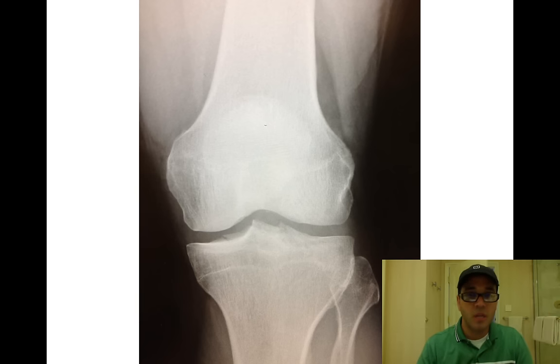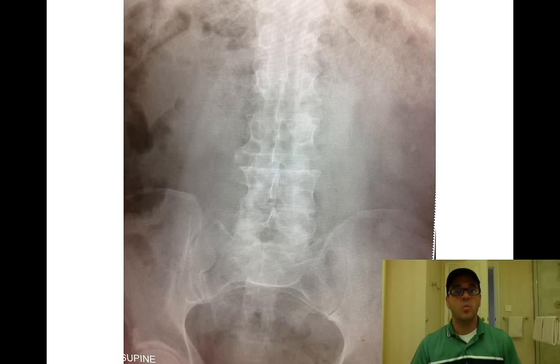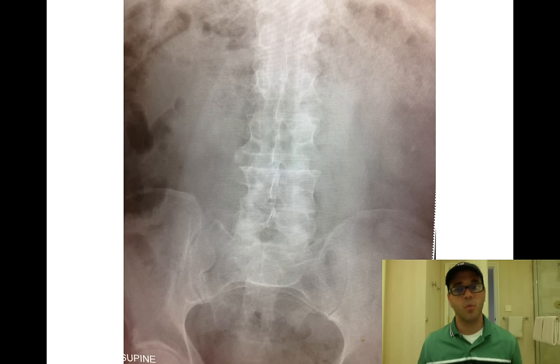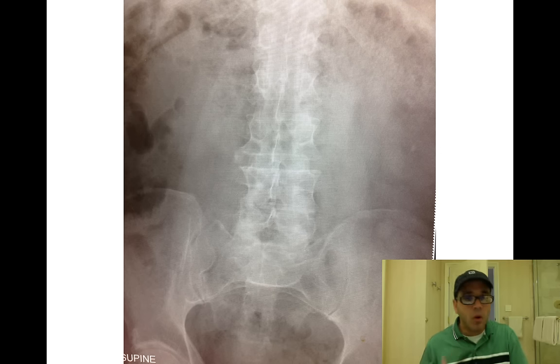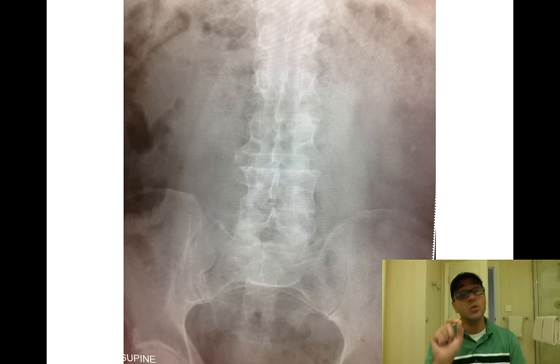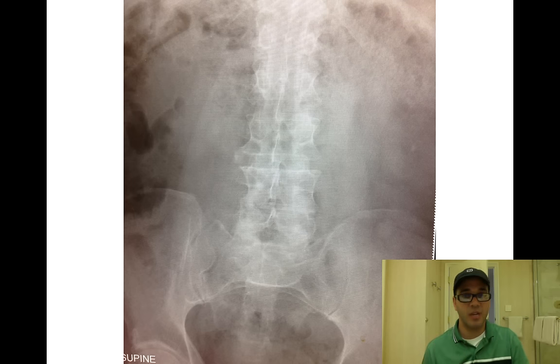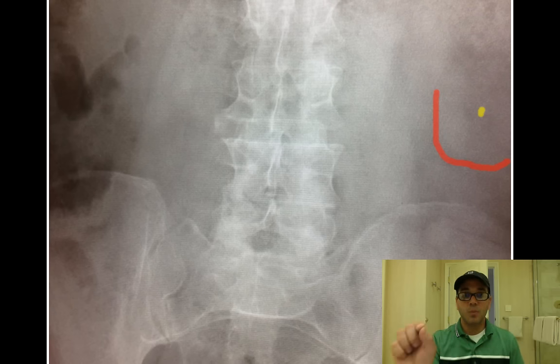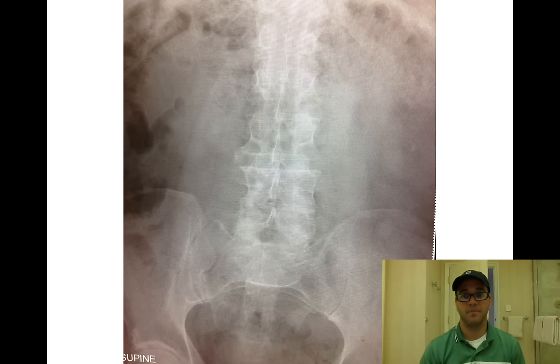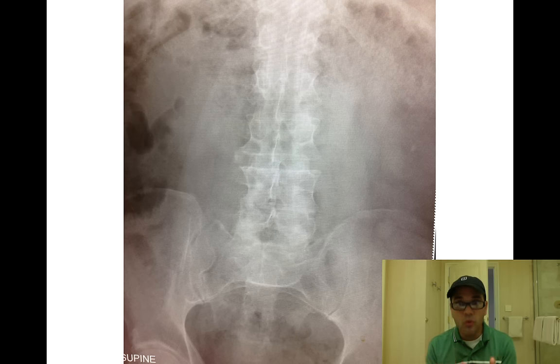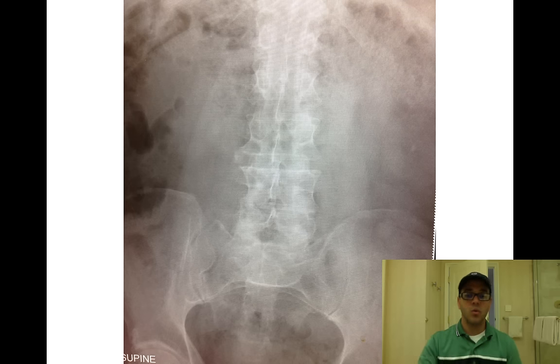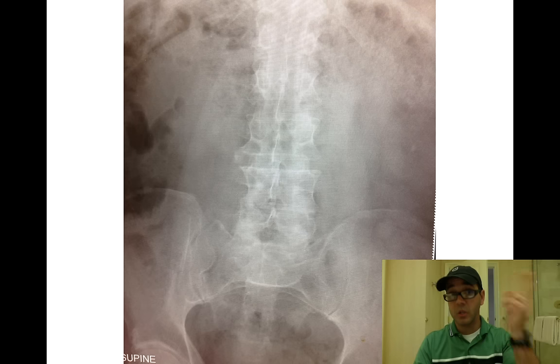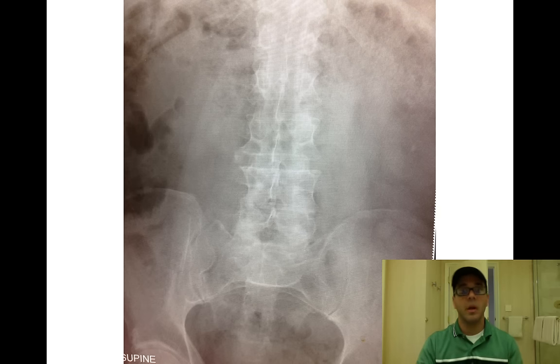This X-ray was done for abdominal pain — the patient presented with nausea and vomiting. We did the X-ray not knowing if it was constipation, obstruction, or something else. There is a very minuscule finding — pause and look carefully before moving on. There it is: the line in red is the kidney border and the yellow spot is a kidney stone. Before the annotation you could barely see it. That's a lot of what medicine is — we're trained to look for things that aren't obvious at first glance. Now that you know what it looks like and where the kidney is, you know what to look for with kidney stones.